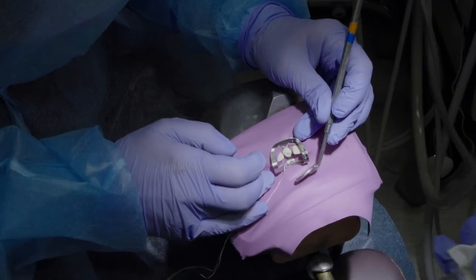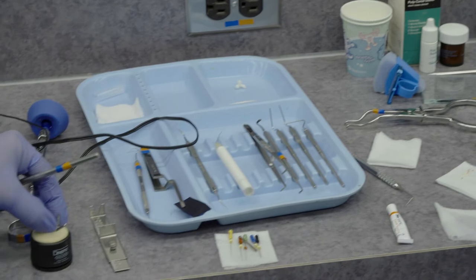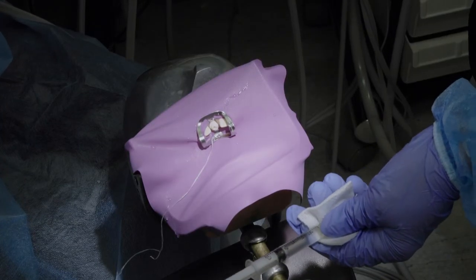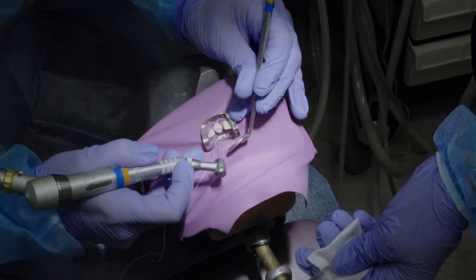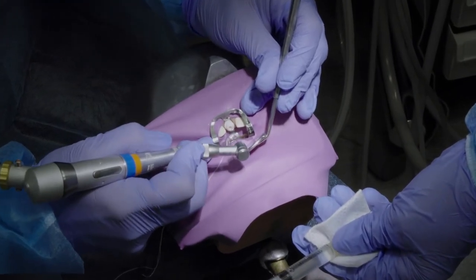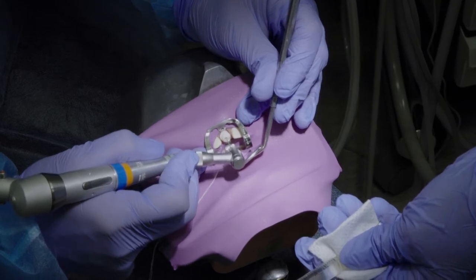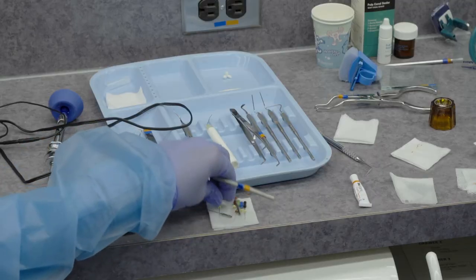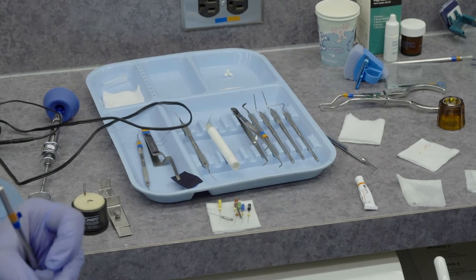The dentist will now utilize the size 2 Gates Glidden while the assistant holds the sodium hypochlorite within the transfer zone. Followed by rinsing with sodium hypochlorite in between each use of the Gates Glidden.